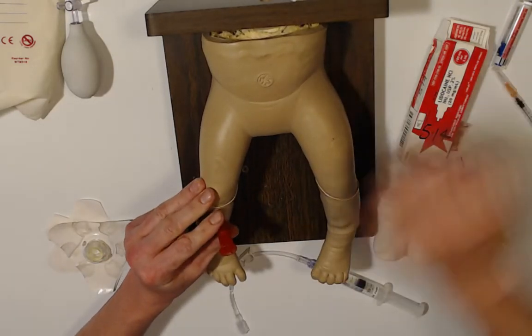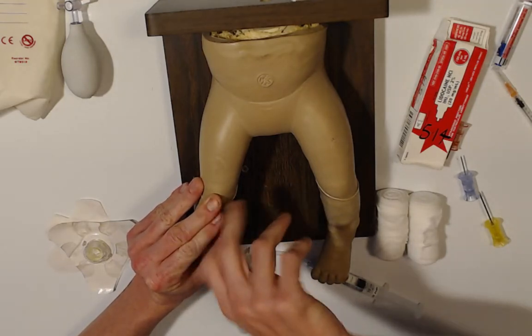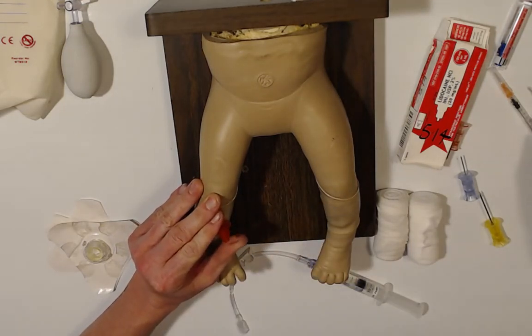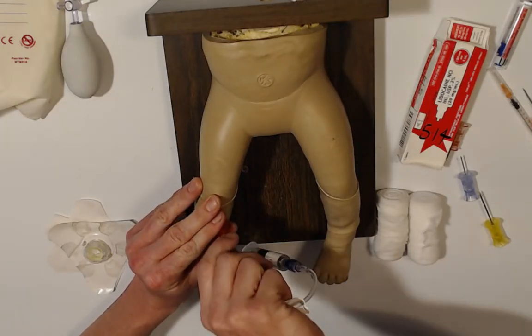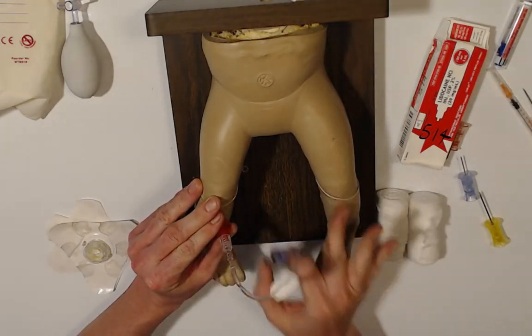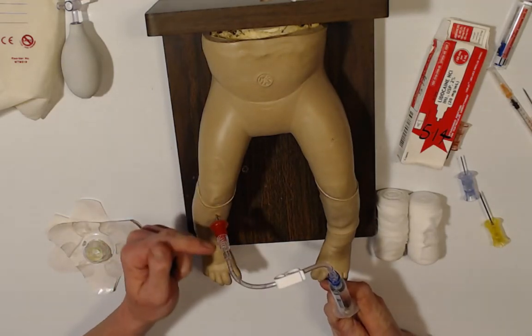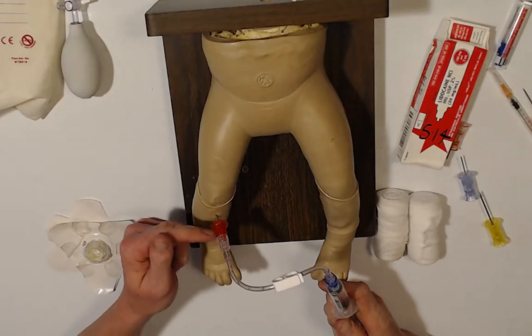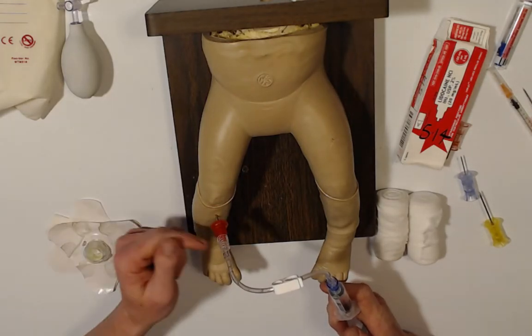Remove the drill. Now hold the base of the hub. I'm going to unscrew the stylet there. And now I can go ahead and put my tubing on. Now first thing you want to do is withdraw. So as I withdraw, hopefully you're starting to see that reddish yellow bone marrow and blood come up. As soon as you see the presence of that, that's good. You don't have to suck a lot of it up.